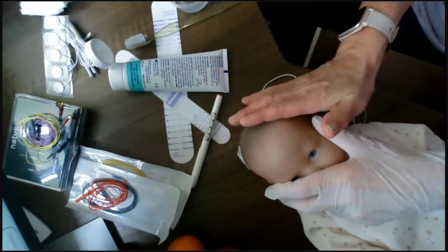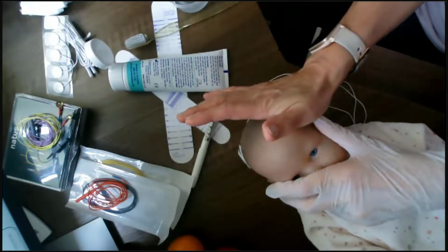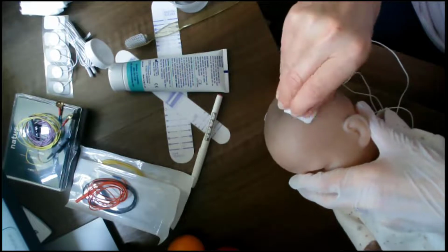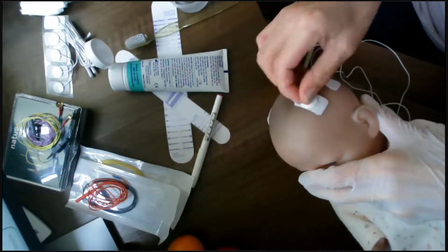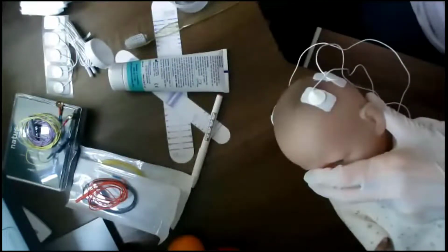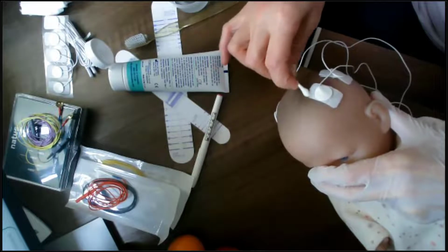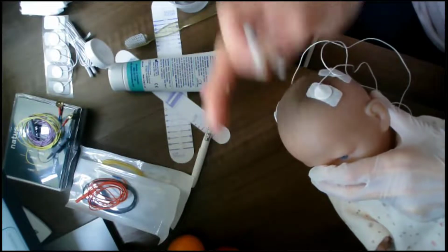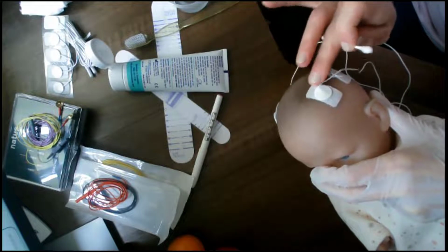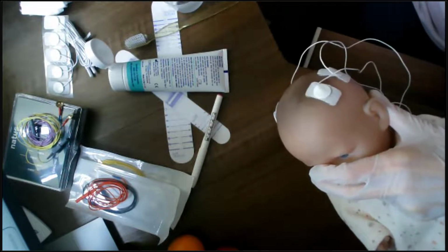Okay, so we talked about preparing the skin. We're going to get the electrodes in position. We're going to run a finger around or even the heel of a hand to warm them. We mentioned rehydrating. If you need to rehydrate, if they're coming up, then you can simply lift the edge, perhaps use a cotton tip soaked in water and rehydrate around the edges, and again run your fingers round to make sure that these electrodes get secured back down.